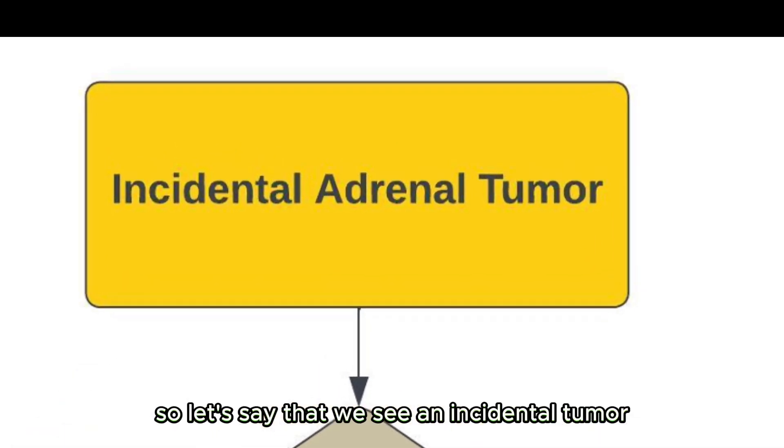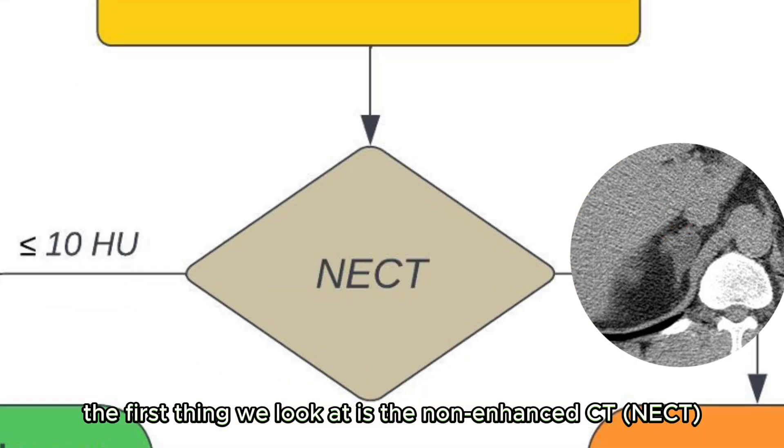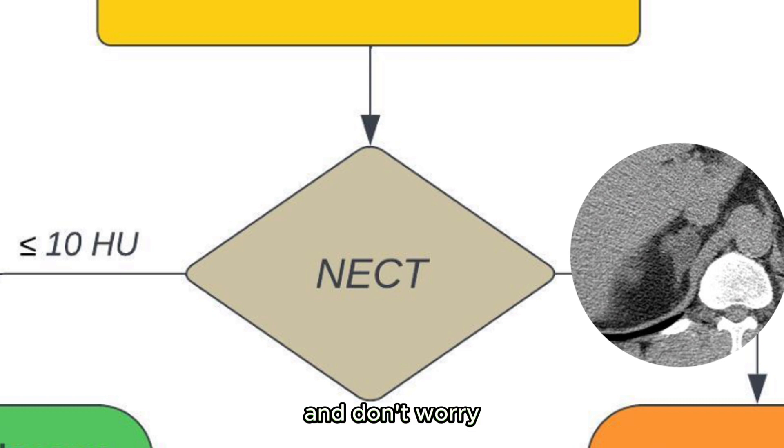So let's say that we see an incidental tumor in the adrenal gland. The first thing we look at is the non-enhanced CT, that is CT performed without any contrast. And don't worry, if we only have a contrast enhanced CT we can work our way around this. I will come back on that later in the video.